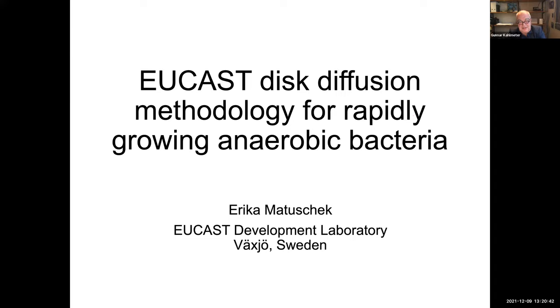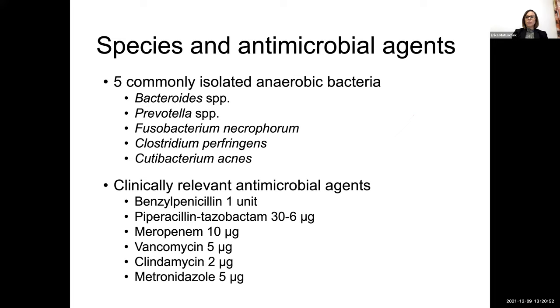Thank you. So if you change the slide, please. As Gunnar already mentioned, when we developed the disc diffusion method for rapidly growing anaerobes, we focused on 5 commonly isolated anaerobic bacteria. And we also focused on some of the clinically relevant antimicrobial agents as a first step. And you can see them here.